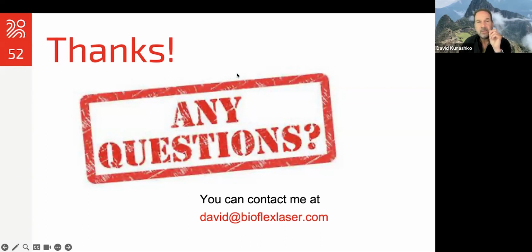Is it okay if you use laser on the couch? Okay, that question is about leaning back on the array into a chair or couch or whatever. I don't recommend that because it has to give off heat and it will get hot, and you need to keep it exposed to air as best you can. So I recommend that you don't do that, or you monitor it extremely carefully, and that you give it a chance to dissipate its heat in between sessions as well. Normally I wouldn't recommend that.